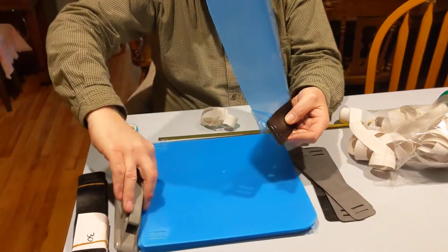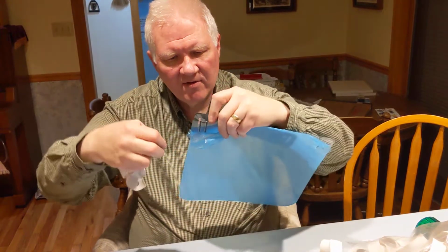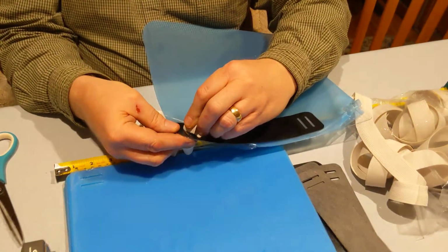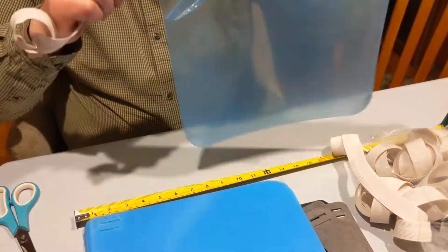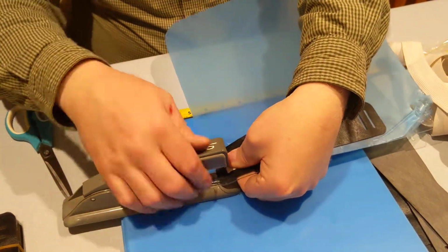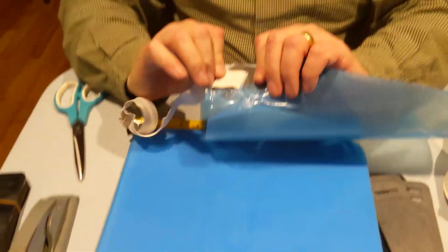So to assemble it with the staple, now take the piece of elastic, holding these, the PETG plastic and the naugahyde vinyl, put the elastic strap through and then come back so that it's coming from the front to the side facing your head, and then back to the front side. And you do not need to stretch it, so can you see the detail here? Then with the desktop stapler, get the staple centered in the space between the edge and the slot, and then just give it a good bit of pressure, and it's stapled nicely, and this will be the side towards the face.